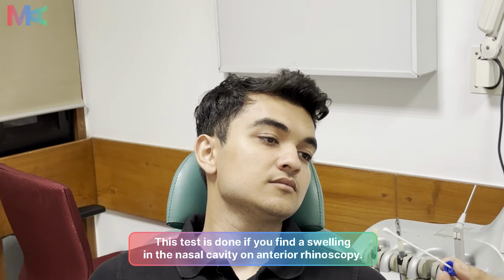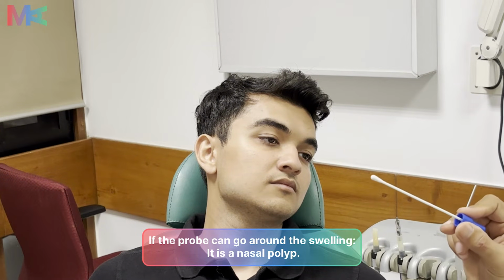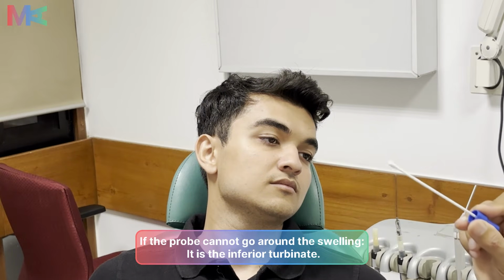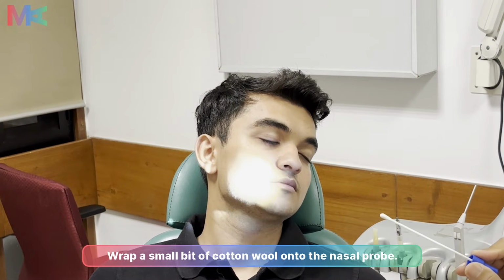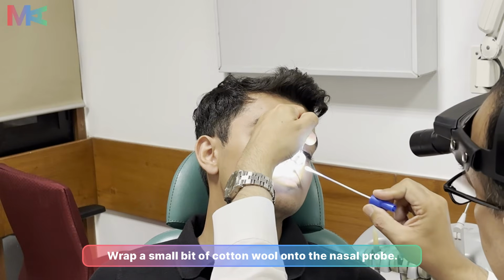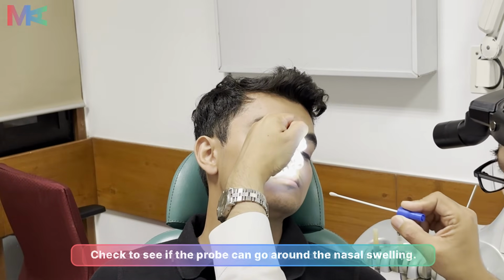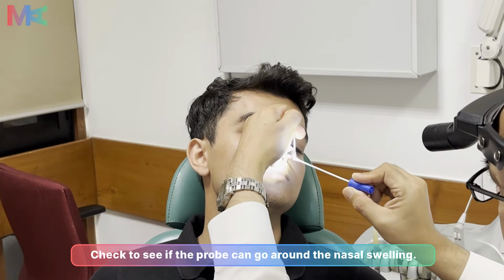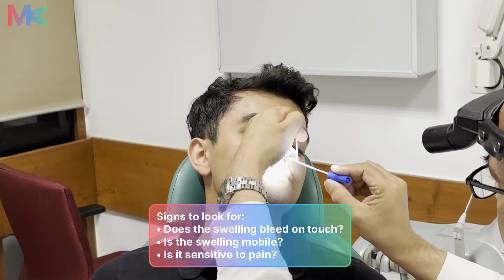So we are doing a nasal probe test. This test will determine the difference between a nasal polyp and a turbinate. If the probe can go all around the swelling, it is likely to be a nasal growth or a nasal polyp. But if it cannot go all around, it is likely to be an inferior turbinate or an enlarged middle turbinate. Similarly, on the left side, you would like to put this and palpate on the turbinate and the septum.